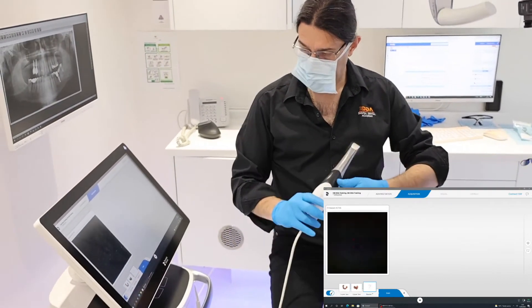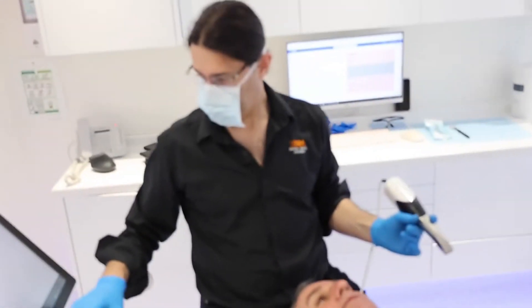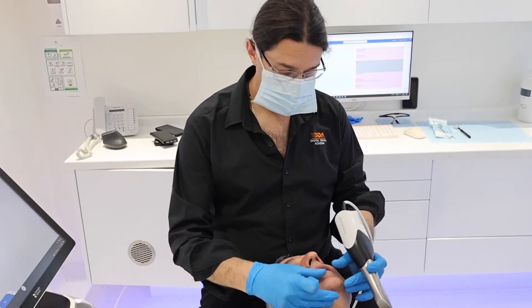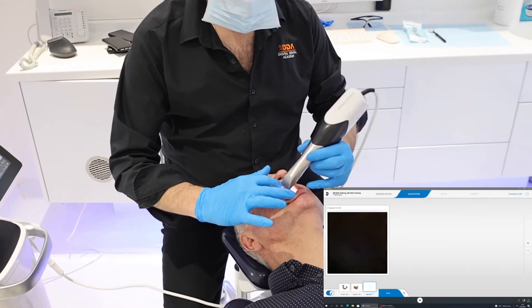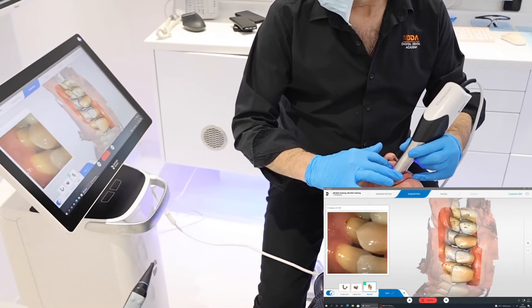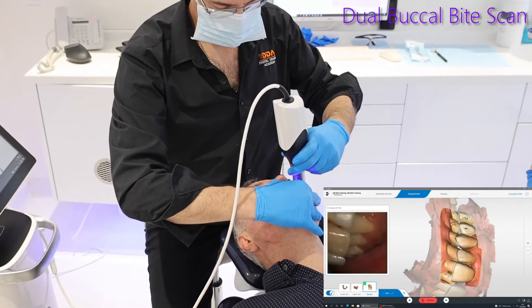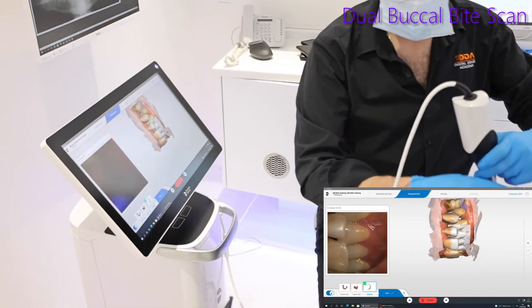The last thing we do is the buccal bite scan in the centric relation position. We'll do a dual buccal bite scan — scanning one side and then the other side to make sure we stitch those STLs correctly. We'll bite things together, and that's done.